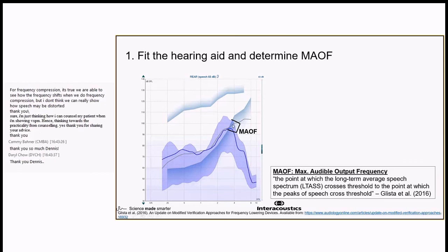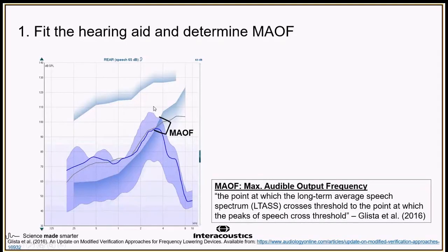I then also bring in that in order to make the sounds available, we have to move them down, because the hair cells and the signal going into the auditory pathway is not good enough at bringing this through to allow them to use it. That instantly states that there's a limitation to what we have from their hearing.